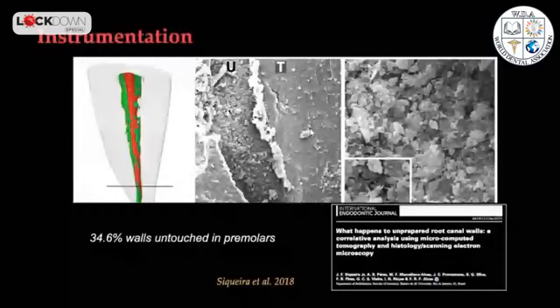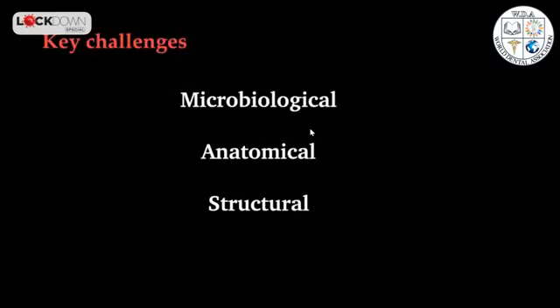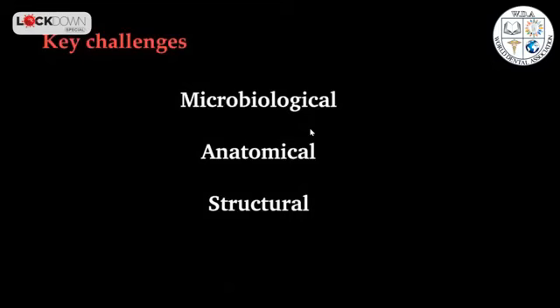So in the areas where your instruments do not touch the root canal wall, you have a lot of debris that is still being retained. This could be microbial biofilms. This can be vital or necrotic tissue as well. So our key challenges in endodontics can be microbiological, they may be anatomical, or they may be structural challenges. What are the microbiological challenges?